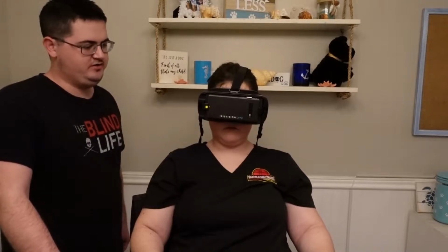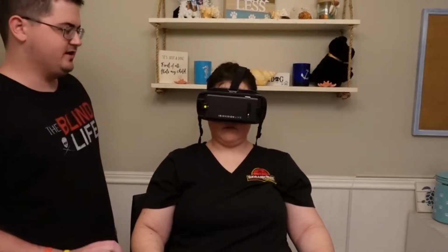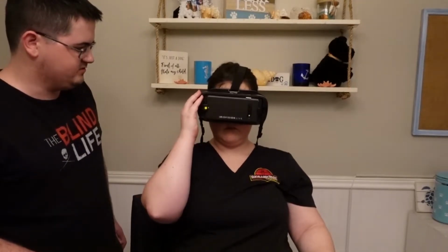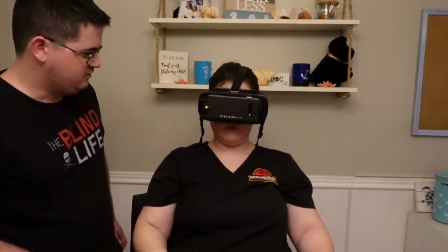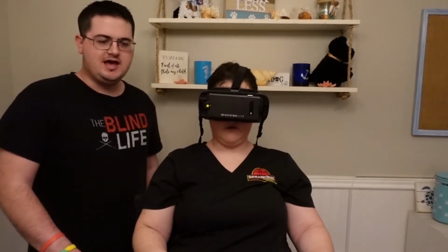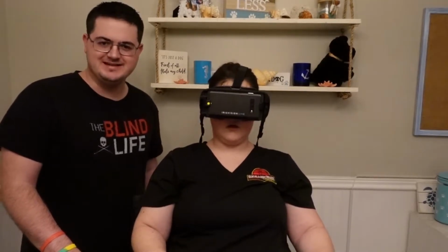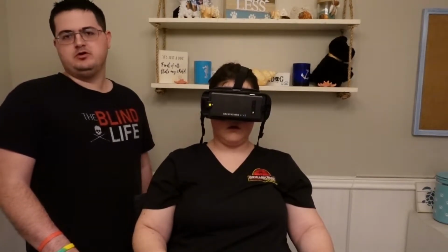We're going to move on to the next one. Next one should be RP. Alright, so Lexi, press the button once. RP. There we go. Good job. So we're in RP, and that's what we have. We're pretty familiar with RP since we both have RP. But what exactly does this mode do?